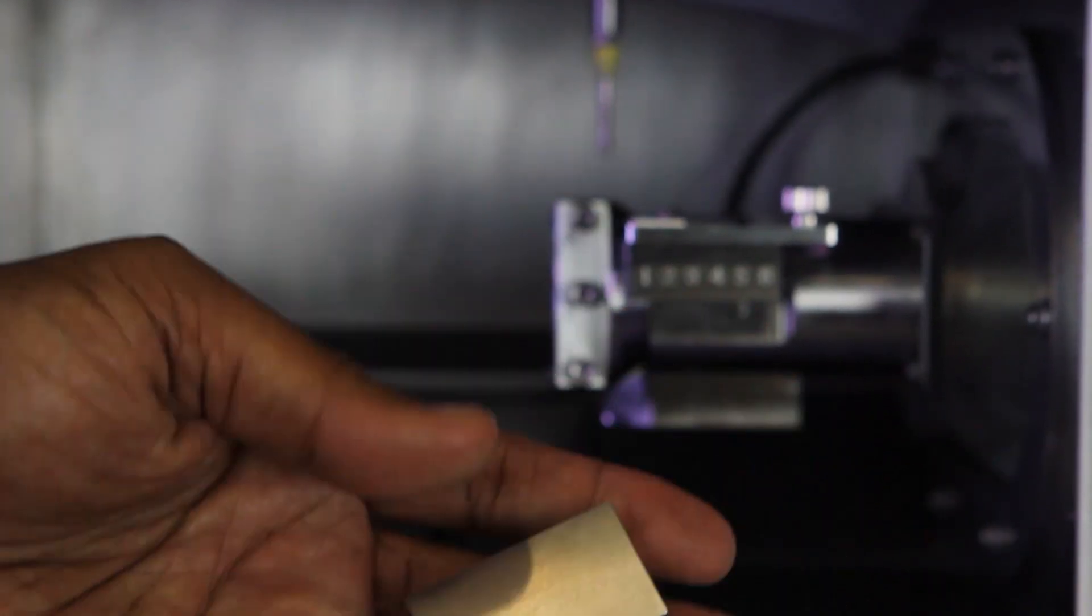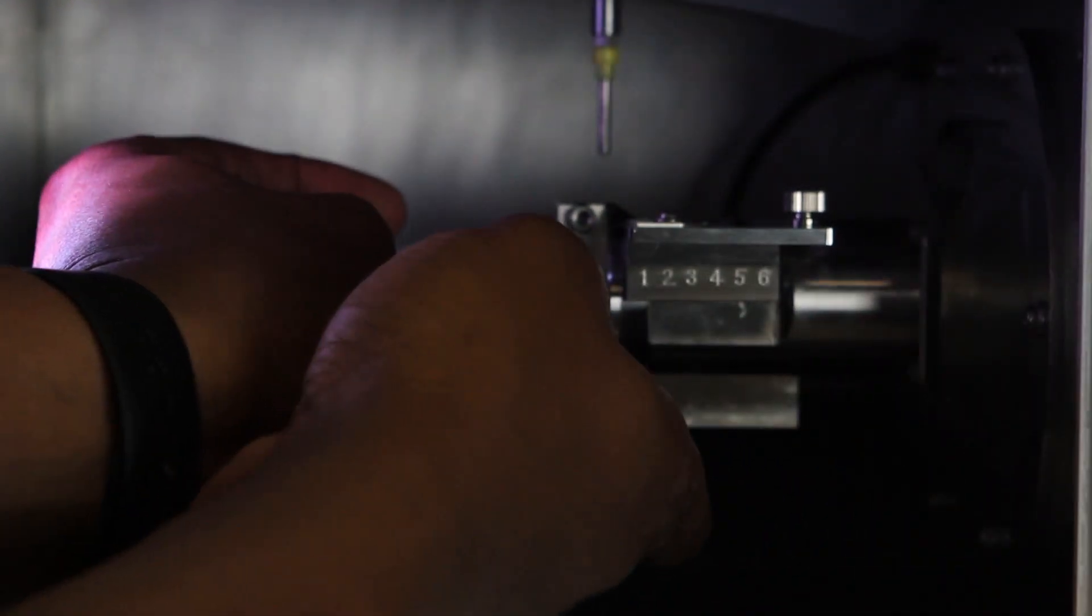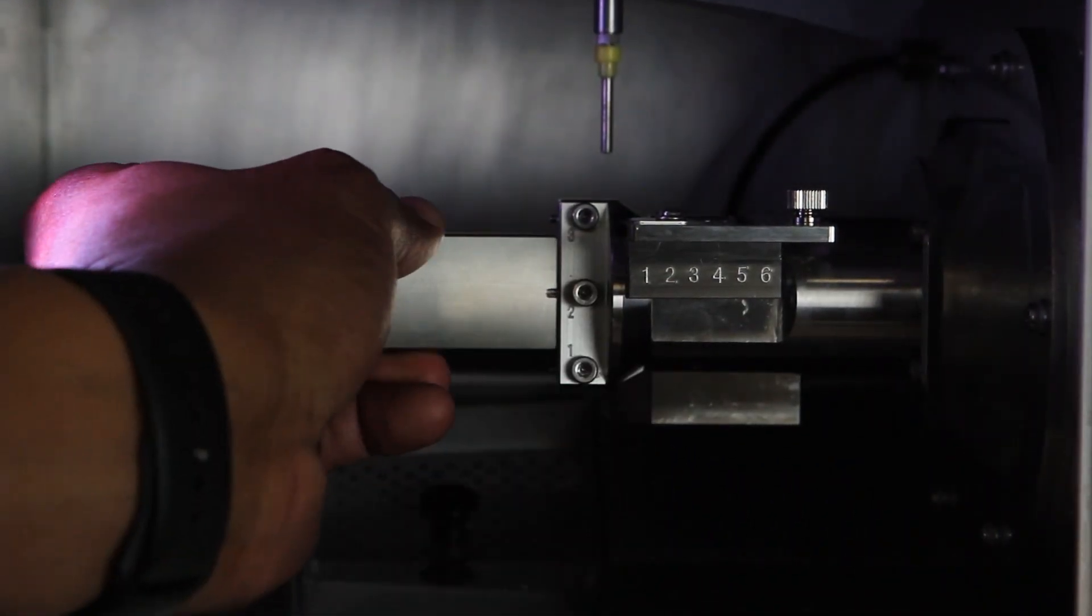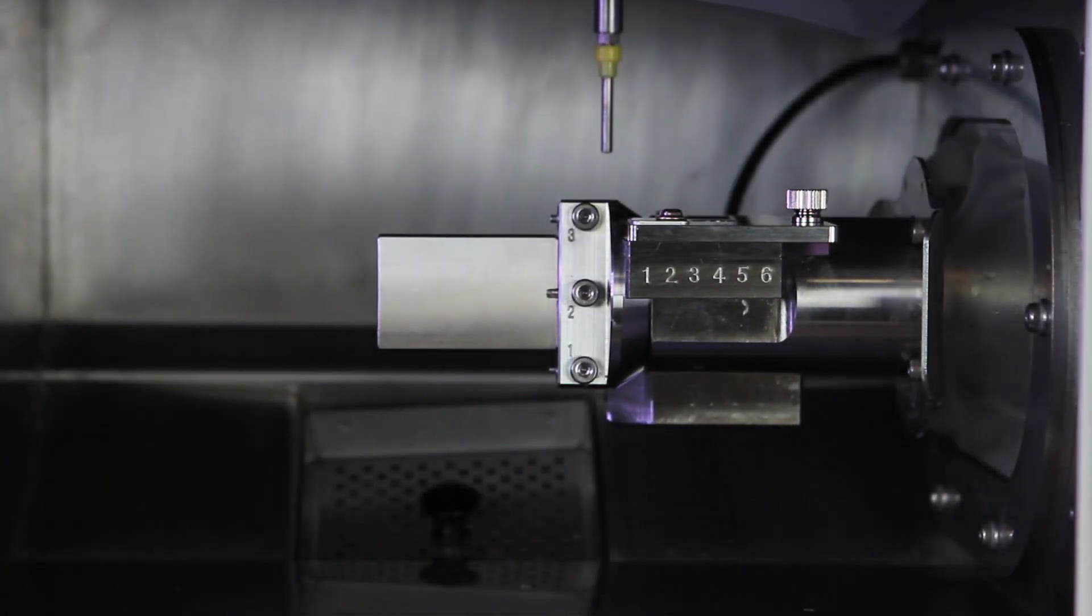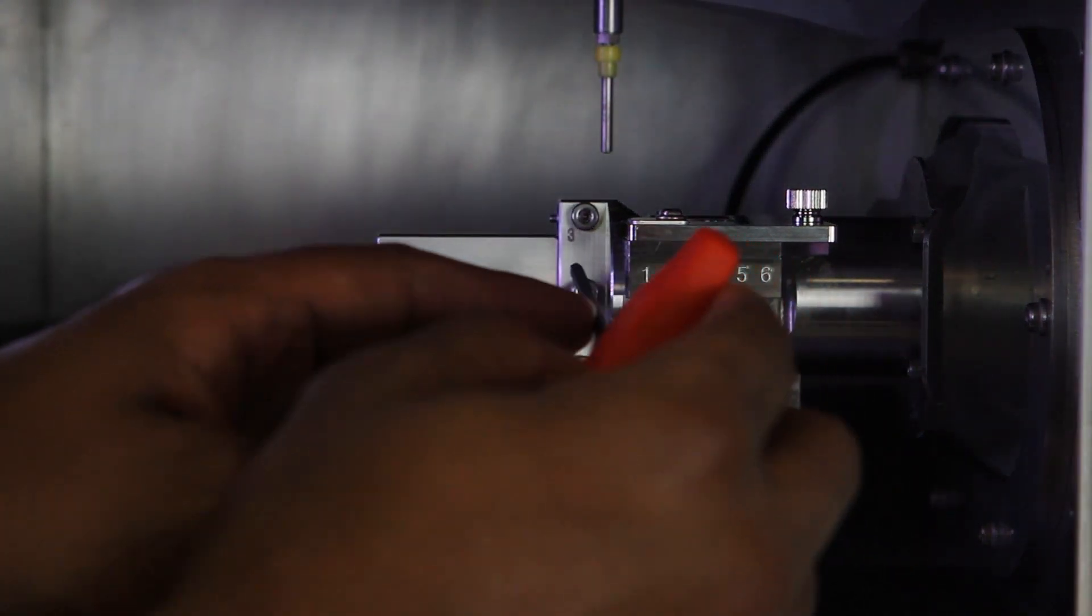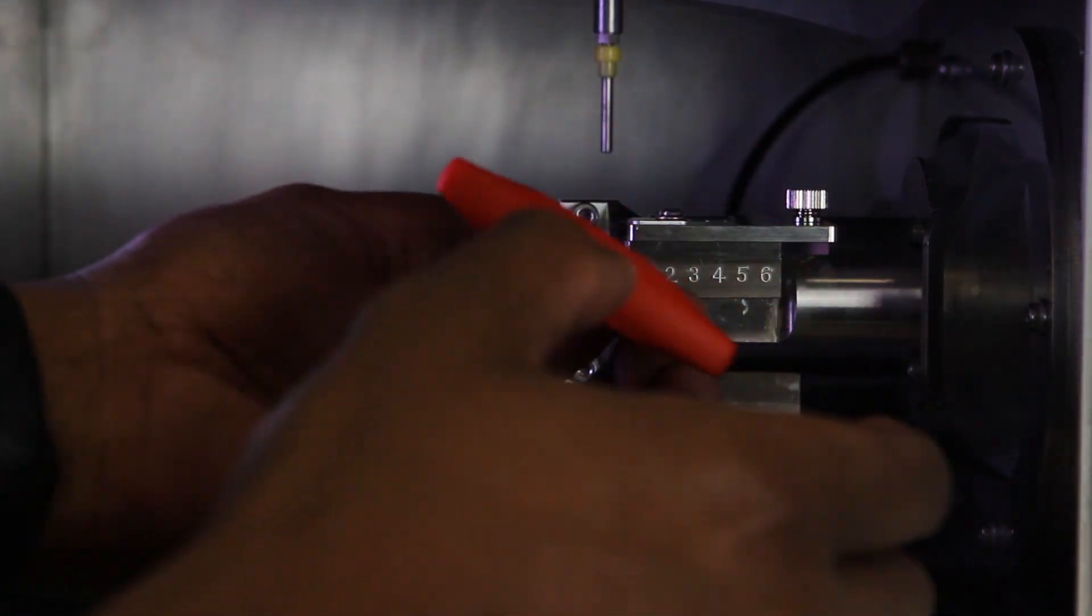Then insert the automatic correction jig. Check to be sure there is no gap between the edge of the correction jig and the mounting part. Tighten the mounting screw with the hexagonal screwdriver to secure the position of the automatic correction jig.